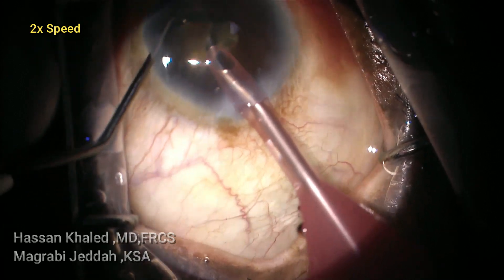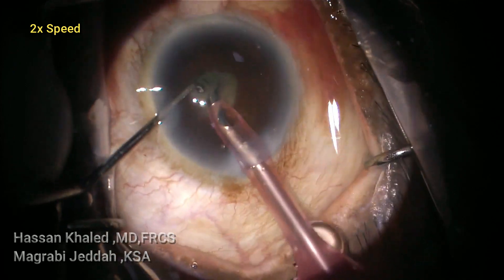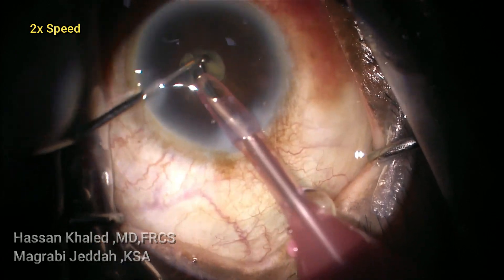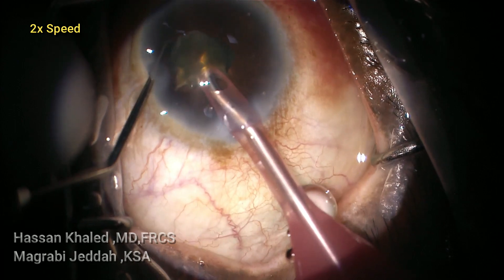You can see the pupil now — it's very small, about 1.5 millimeters. It is very difficult to emulsify this cataract through such a small pupil.